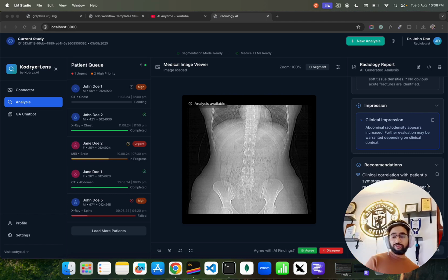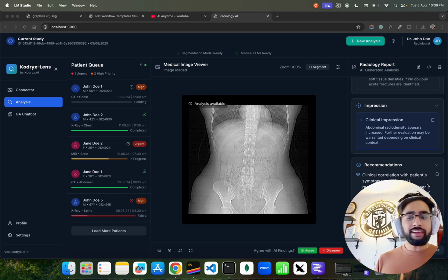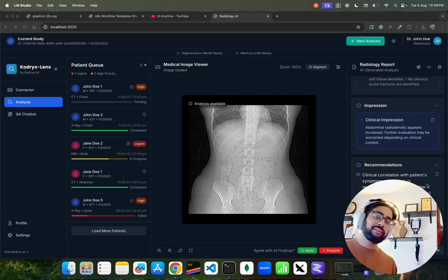This is important, guys, because the way I have designed the prompts, I have to ensure, by putting some guardrails, that it doesn't make any diagnostic decisions. It's not a diagnosis engine, basically. It's not going to do any diagnosis, or any differential diagnosis either. I don't want to build tools which are going to influence decisions of radiologists or doctors or clinicians. That doesn't make sense, right? It should just bring up all the anomalies and insights and let the domain experts, or the practitioner, decide what they want to do with this.